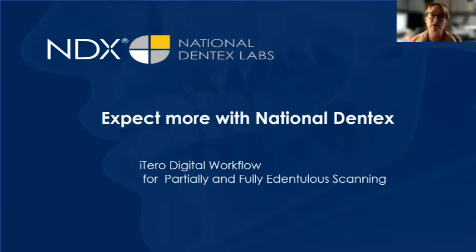We are both certified trainers by Align Technologies on the iTero scanner, and the whole scanning of partially edentulous and fully edentulous patients is still new, right? It's an evolution that we're going through. Just like we shifted from rubber base to polyether and polyvinyl siloxanes, we're now migrating and evolving through the different types of edentulous and partially edentulous scanning we do.